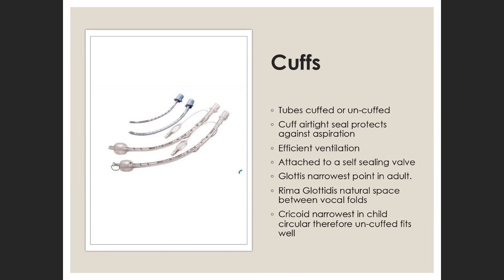All right, in the adult, just pointing out again the guide to help you with intubation. In the adult, notice that there's a tip, then there's a cuff, and you see these two lines? It's on both these tubes actually. That is the guide in the adult to say that the cords should be at least at that one and definitely not above the upper one. Ideally, it should lie between the two so that we can be certain that it is not down too far.